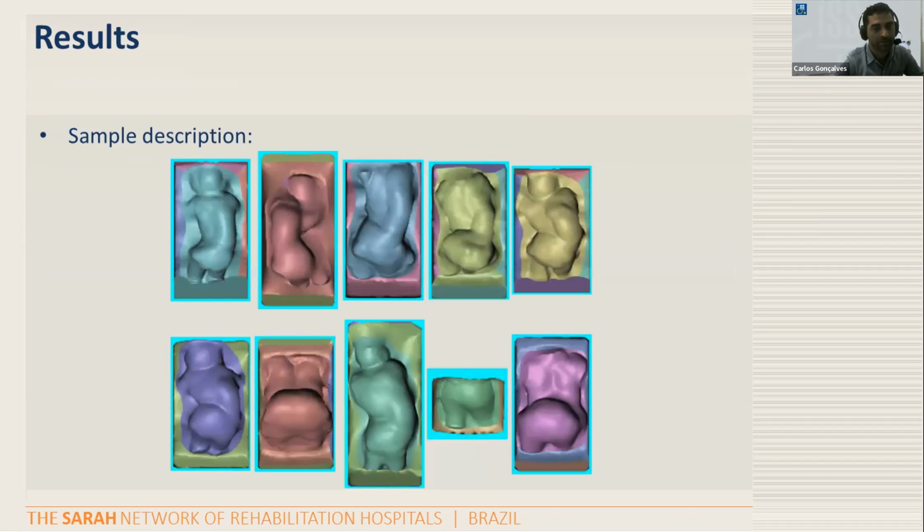Since pictures speak more than graphs, here are some pictures of our solutions, our cushions and backrests still in one piece, edited in Mesh Mixer. So it's very notable to see that despite being a low-cost scanning solution, you can acquire very well the contours of the patients.